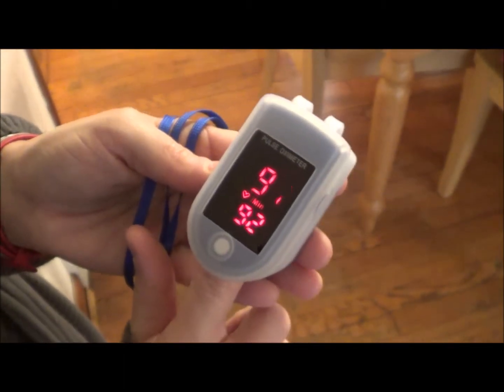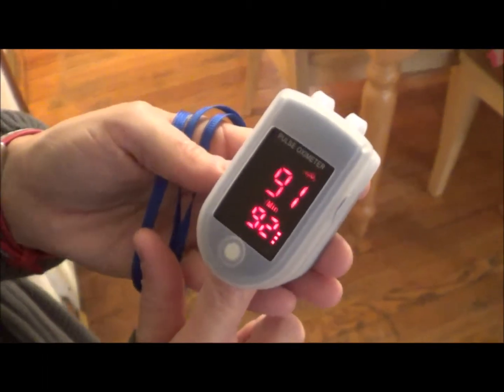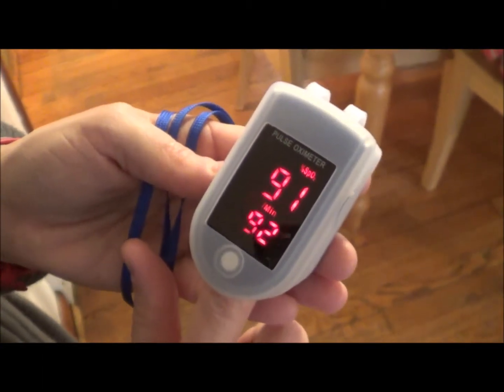So you can see on here, the top number is the SpO2 level — the oxygen saturation level — and the bottom number is your pulse or your heart rate.